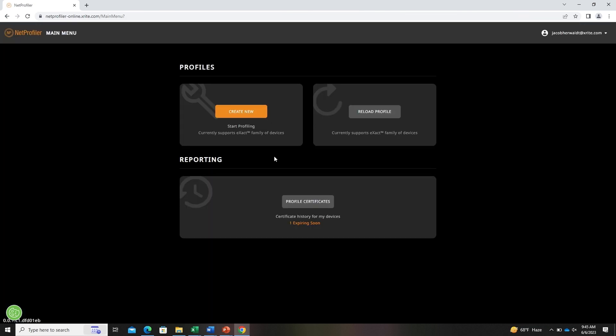Once logged in, you'll land on the main menu. You'll need to click the create new button to start the profile creation process.